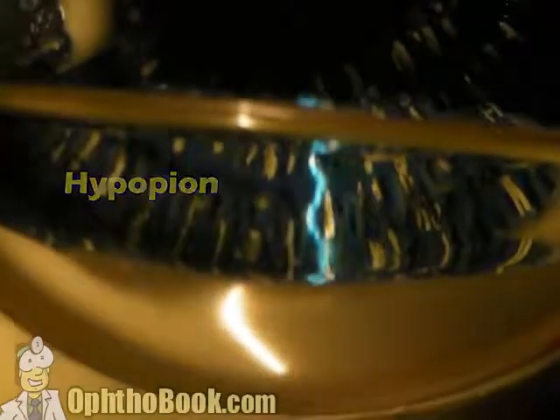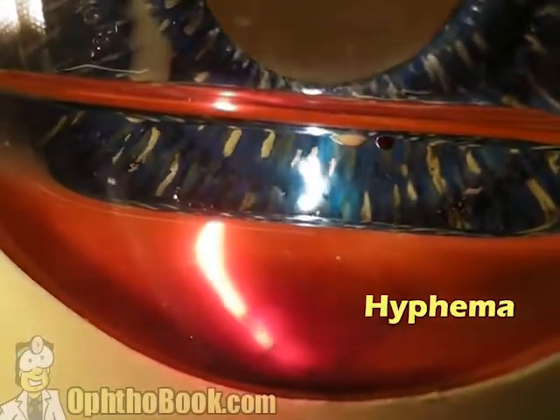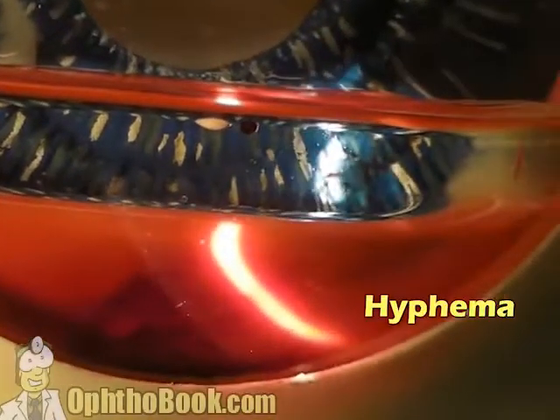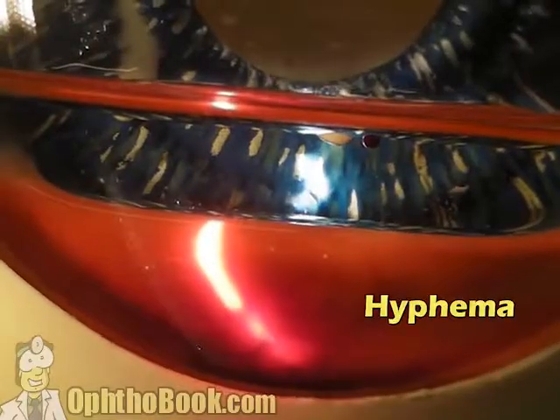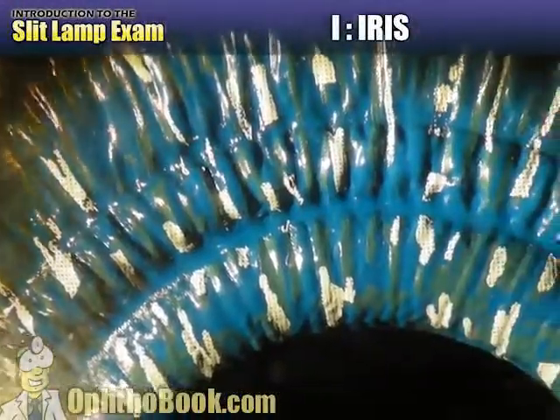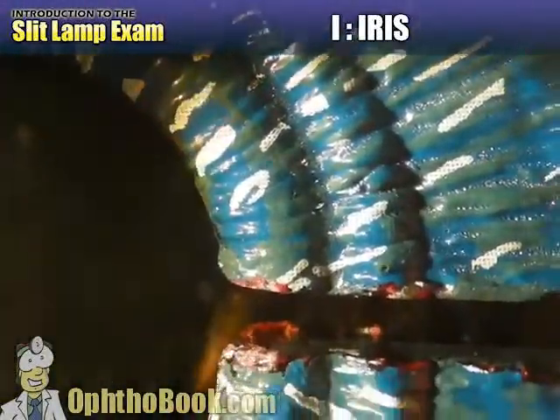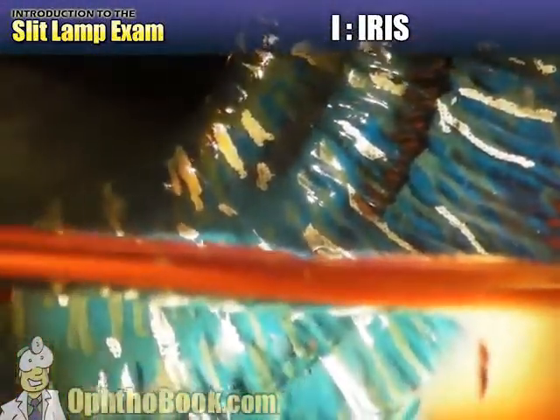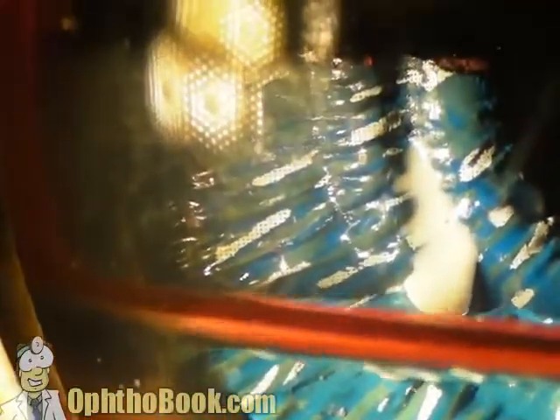Change that to red blood cells and this is what we call a hyphema, or bleeding in the bottom part of the eye. Moving on to the iris — by far the easiest part of the eye to look at because it's flat and therefore always in focus, and there's usually not that much pathology on it.